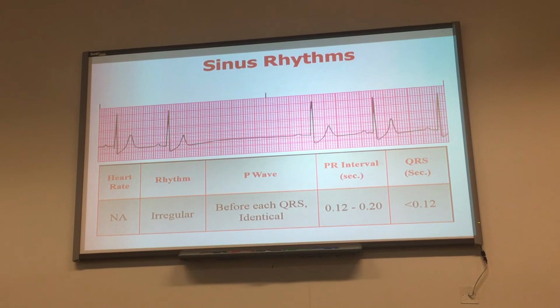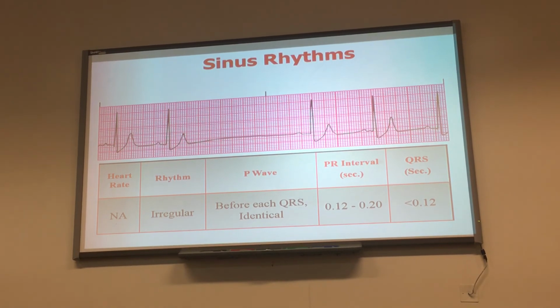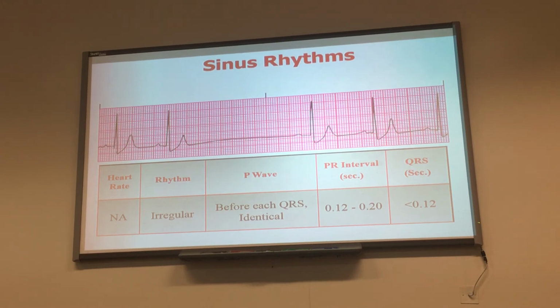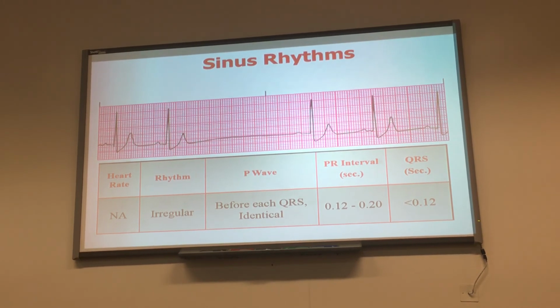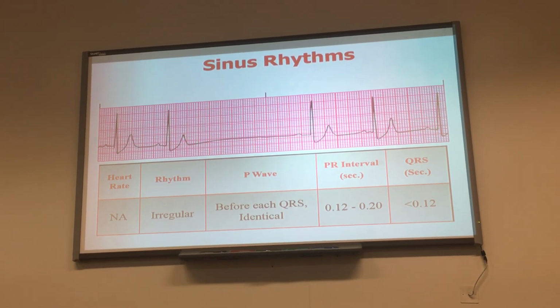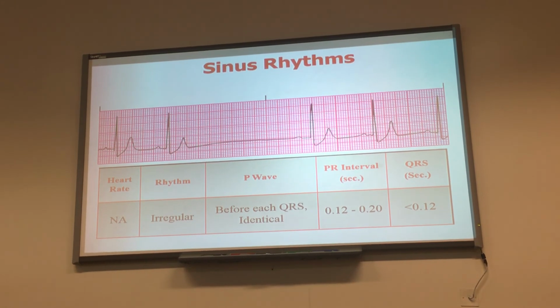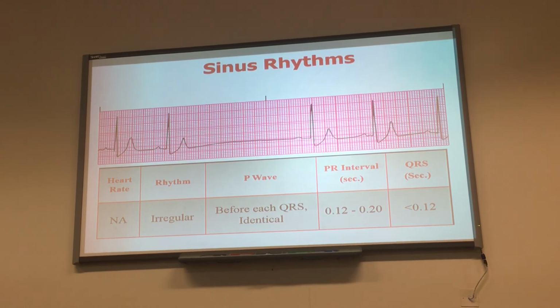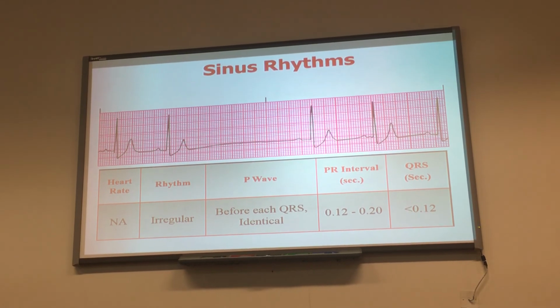And with the exit block, you'd see the P waves, right? It will be the same, because if the sinus node fires, by ECG we don't see anything, unless it is conducted to the atria and the atria activate, then I see a P wave. There's a criteria for it, but you don't need to worry about it. Generally, in final year we mention it, just for information, not to remember.